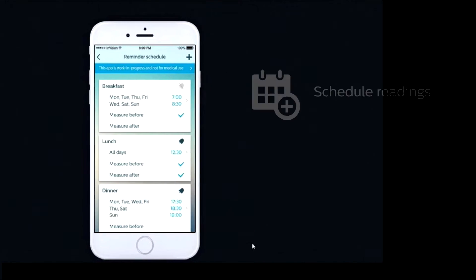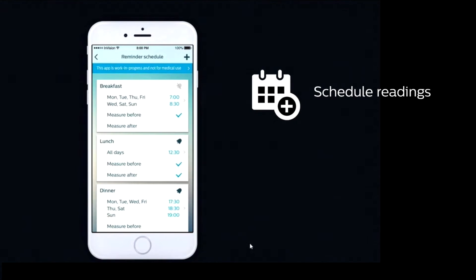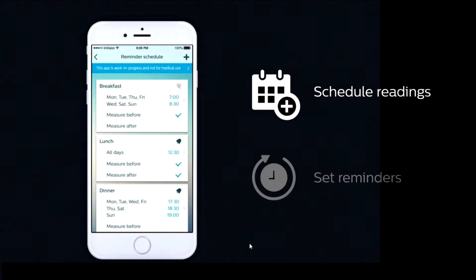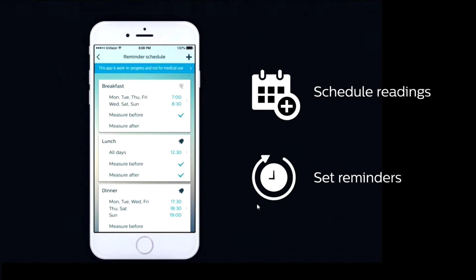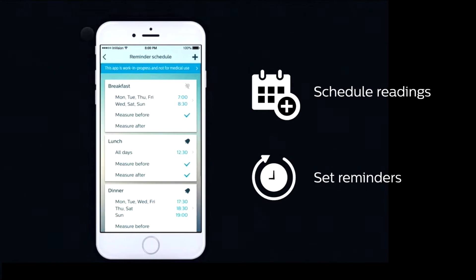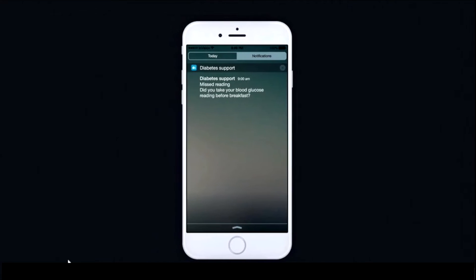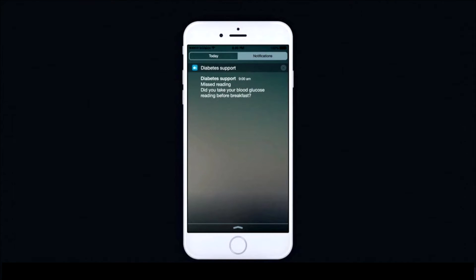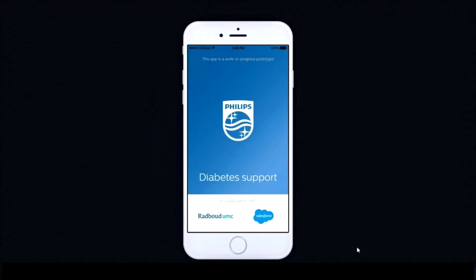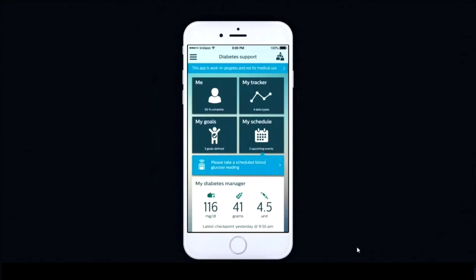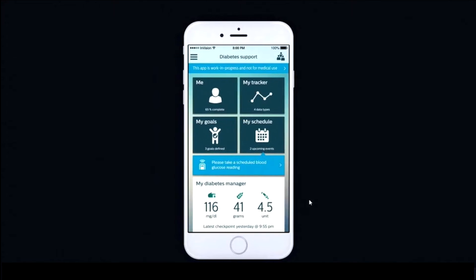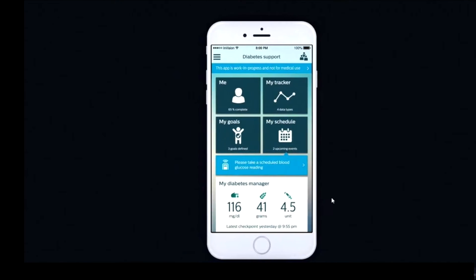It begins when an individual schedules a reading. They're able to set reminders and requests for notifications. When they miss a reading, they get a notification of a missed reading, and from there they're able to drill down to the part of the app where they're able to enter a reading.